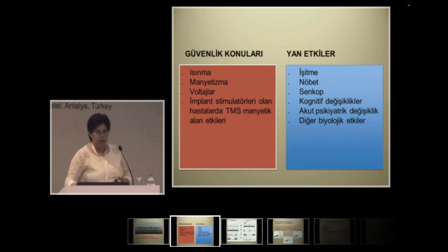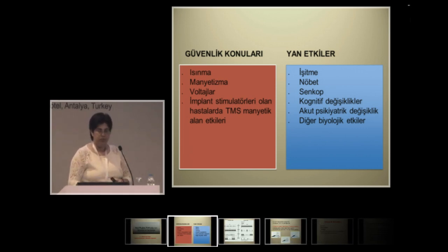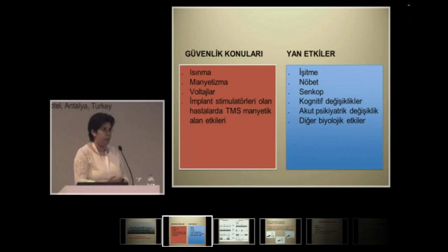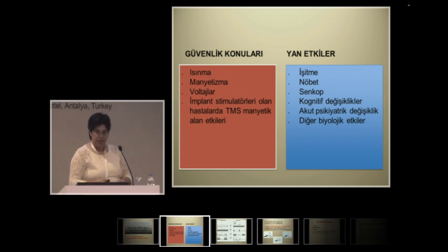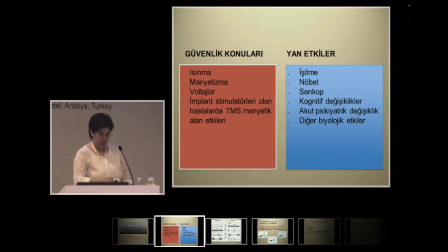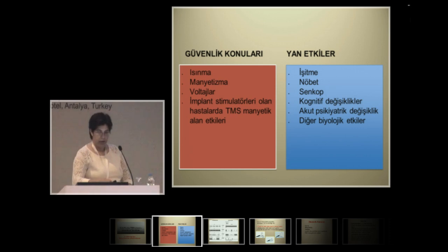And secondly, I will discuss the adverse effects, such as seizures, syncopes, cognitive changes, acute psychiatric changes, as well as other biological effects. This is an outline of my presentation.